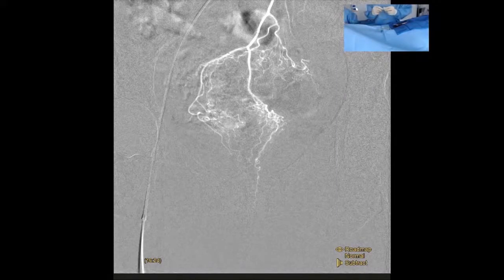So on your previous angiogram, you commented how we were only seeing 2 branches when there's usually 4 branches. Exactly. So do you think in this image that proximal branch is actually the other two branches? It looks like they may be extending downward towards them. That proximal branching point. Absolutely. Yeah. So once you're 4 centimeters down each of those main right and left trunks, then there are branches that go right down the middle that are probably posterior branches as well.